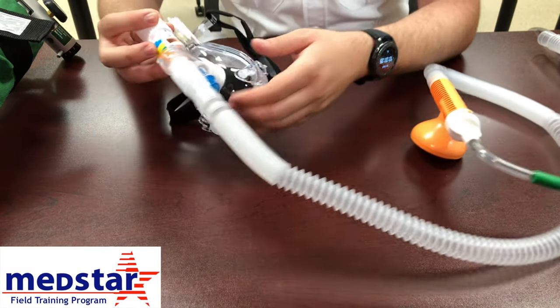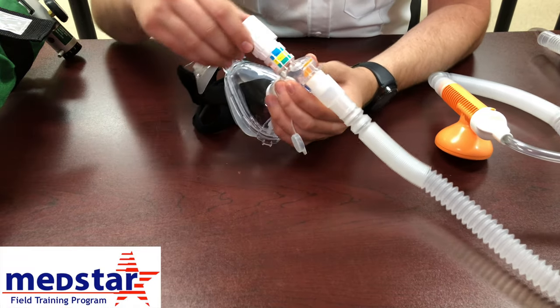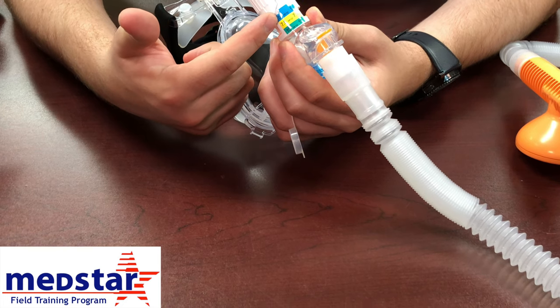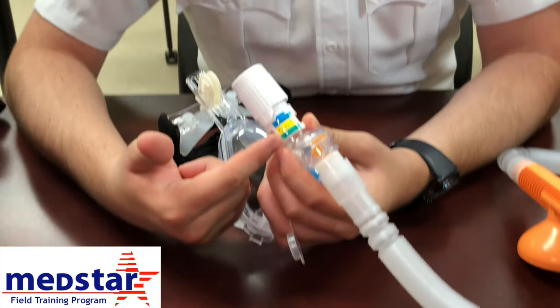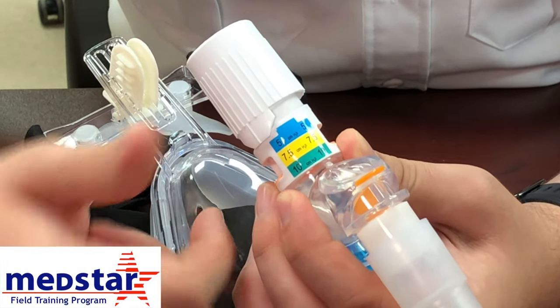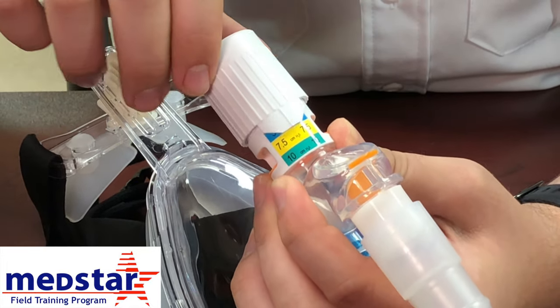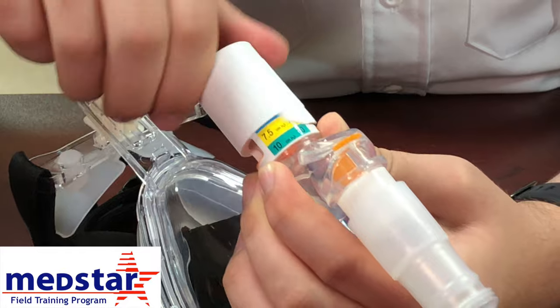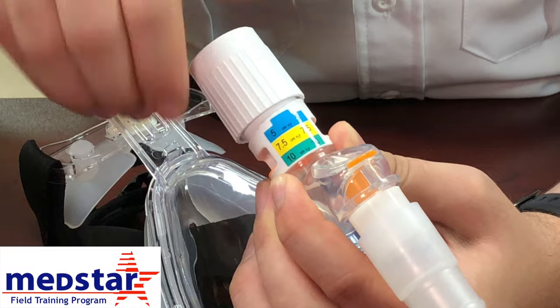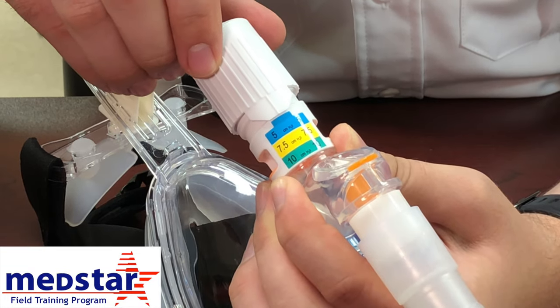There are a couple of items you need to know how to use. On the front of the mask, there is a PEEP valve adjustment. There are three different PEEP settings: 5, 7.5, and 10. To adjust the PEEP, all you have to do is dial it down. Now it's at 7.5, and now it's at 10. To change it back, just dial it the other way. That's how you adjust the PEEP on the CPAP.